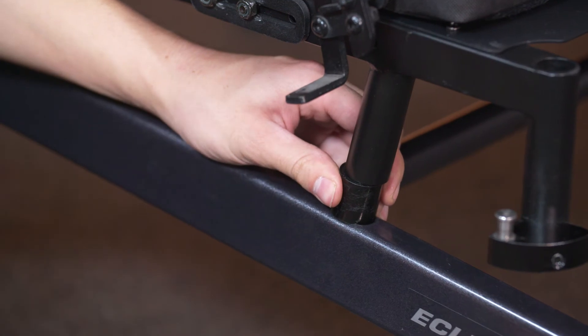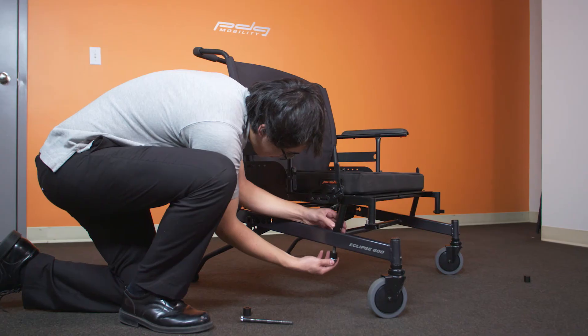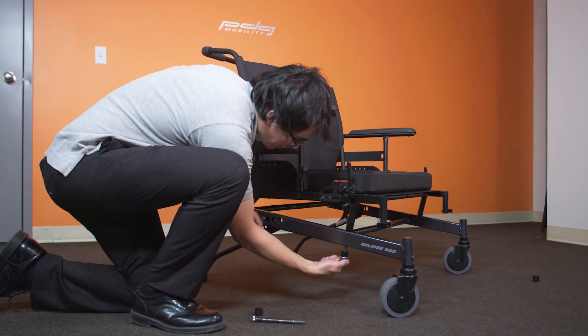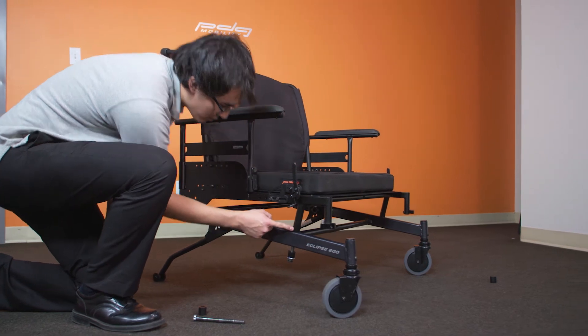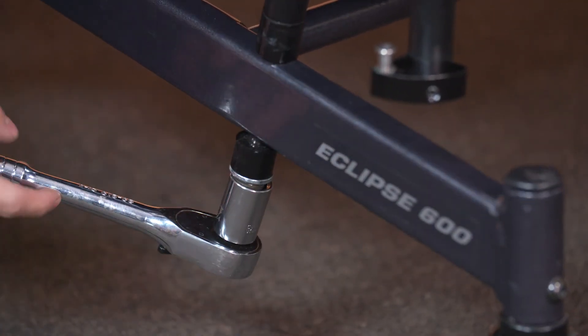Insert the spacers and shock absorbers in the configuration required to obtain the desired seat height. Reinstall and tighten the half inch bolt. Repeat the procedure on the other side and ensure that both sides match.